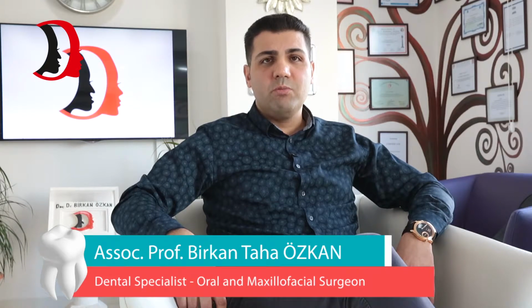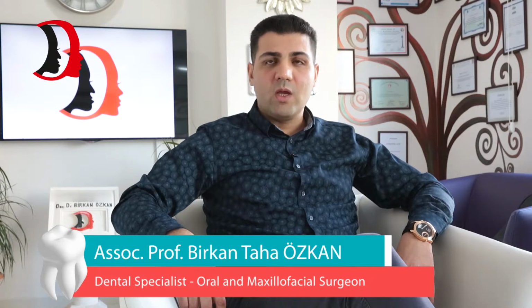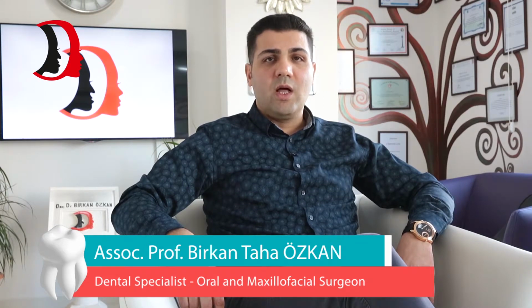Besides the traditional implant operation, I recently use flapless implant surgery with laser. Under local anesthesia, gingival removal is made with the laser without bleeding within a short period of time. Then implant insertion is made within just 1.5 minutes. It's a very good time for implant insertion. I can tell you this is a short procedure, about the time between opening and closing your mouth.